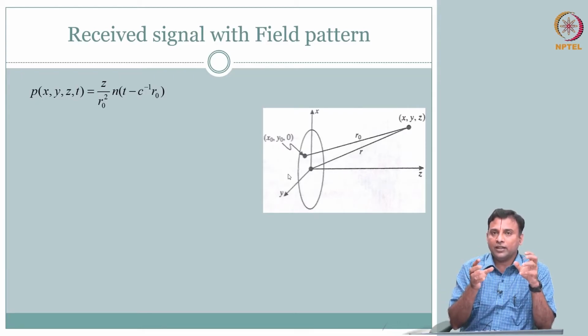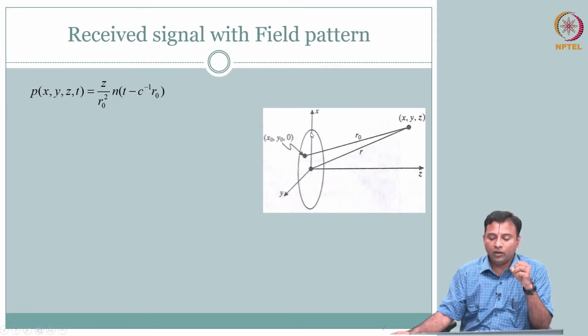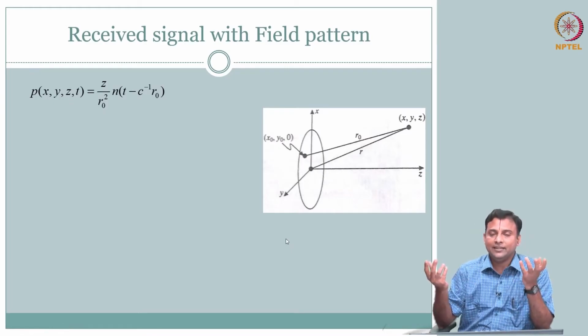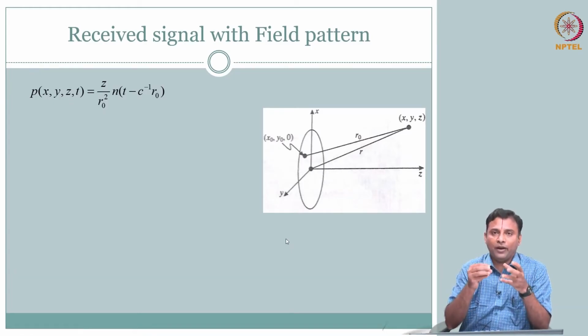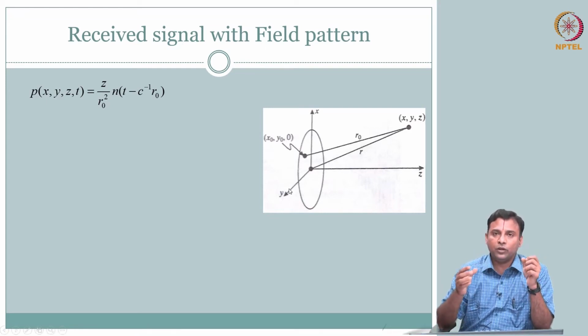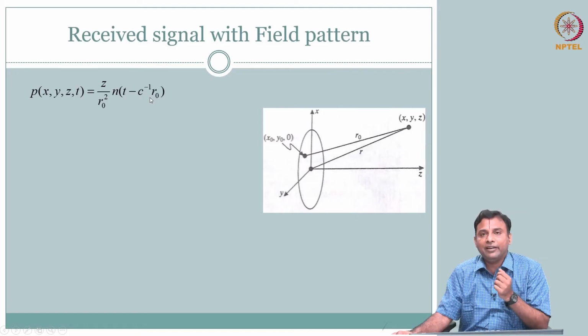So, it is not a spherical wave for that reason, even though you could pretend this disc, this area, is composed of a collection of several points. Area is nothing but a collection of points. So, you have multiple points, each point is going to send out a wave which is n(t - r/c), that is your wave that is travelling.